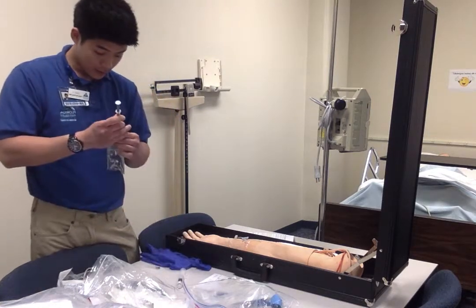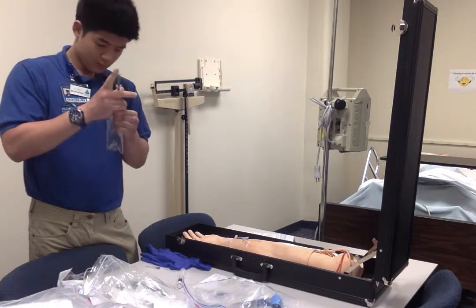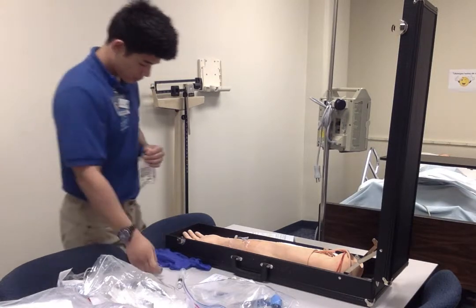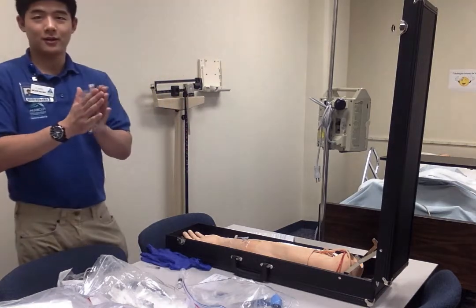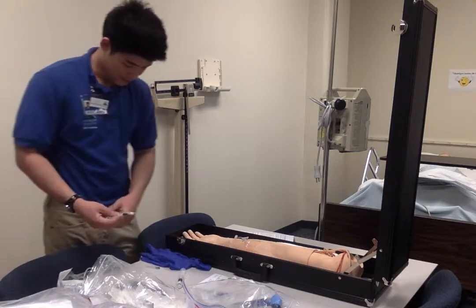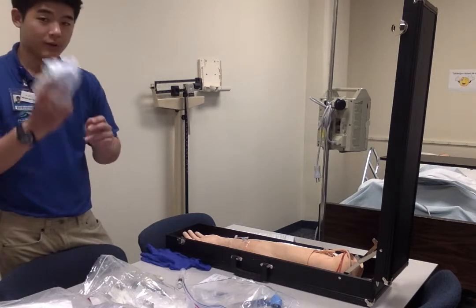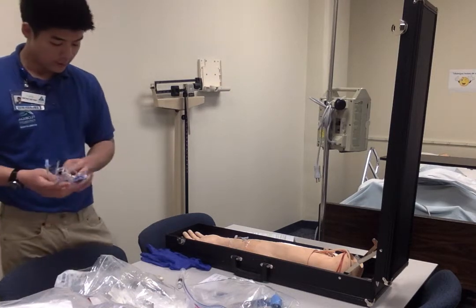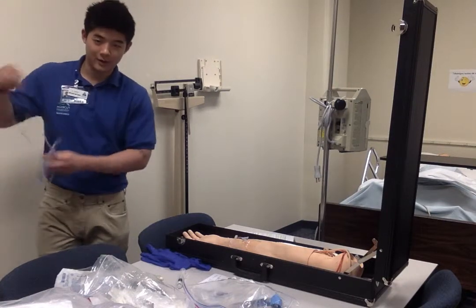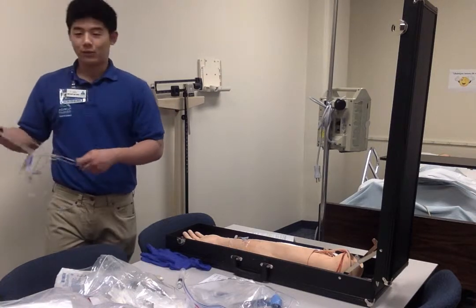I'm going to add the medication. Shake them. Alright, so this is good now. And what I have to do now is prime it, and I'll be doing that with the primary tubing. So this is it right here. And make sure you always label them. Label your IV meds bag and your tubing. I always forget to do that.